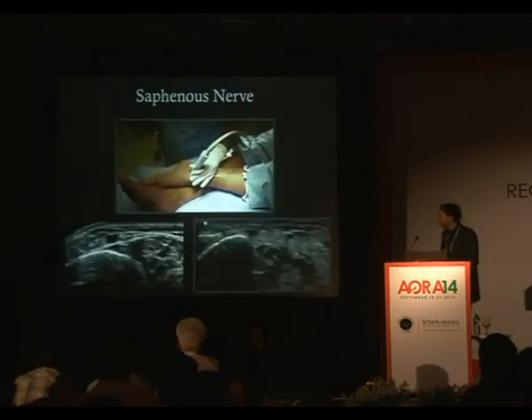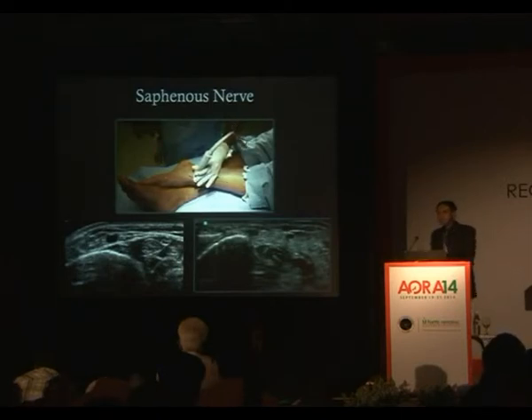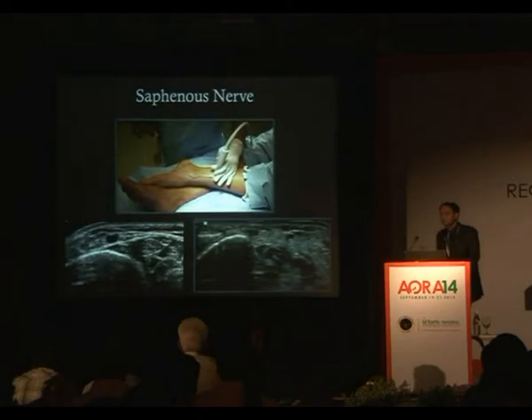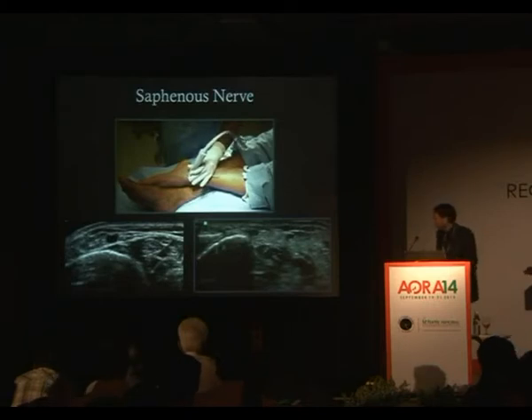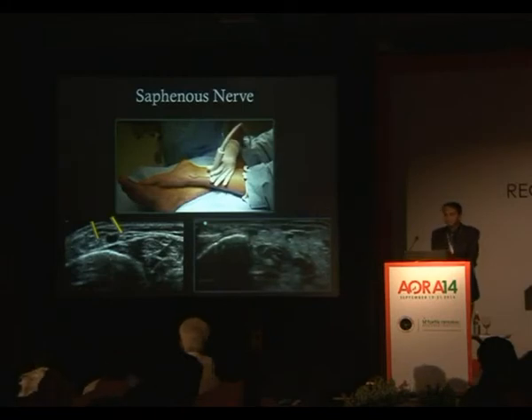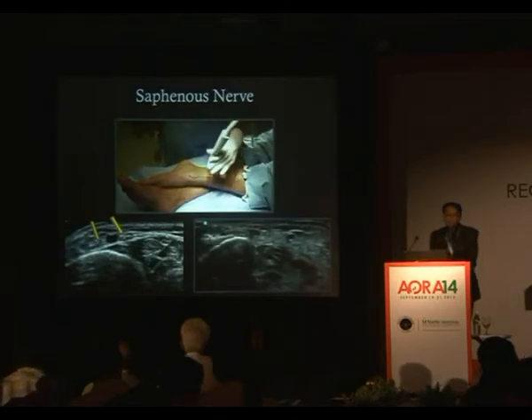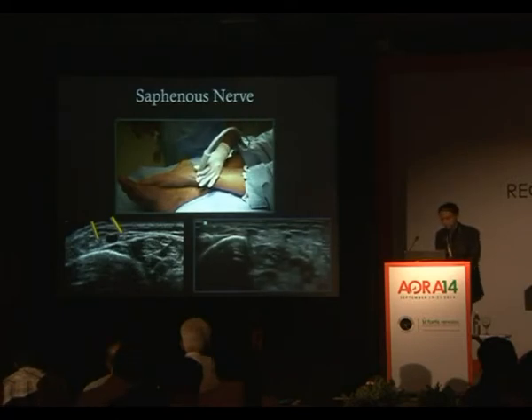The saphenous nerve. Again, the landmark, the great saphenous vein. So we're scanning on the other side of the medial malleolus, just looking for the vein. Now the problem with scanning veins is even the weight of a light transducer like this will compress the vein. So you don't always get great pictures. The saphenous nerve at the ankle at this point would have divided further. And sometimes there's also a question whether there's any role of the saphenous nerve below the ankle. So this is where you would likely do the injection. If you don't see a nerve, which is more or less the case most of the time, just do an infiltration around the vein, which is what you're seeing here. I'm just putting in a hypodermic needle and injecting around the vein. This should be good enough for you to get a saphenous nerve block going.